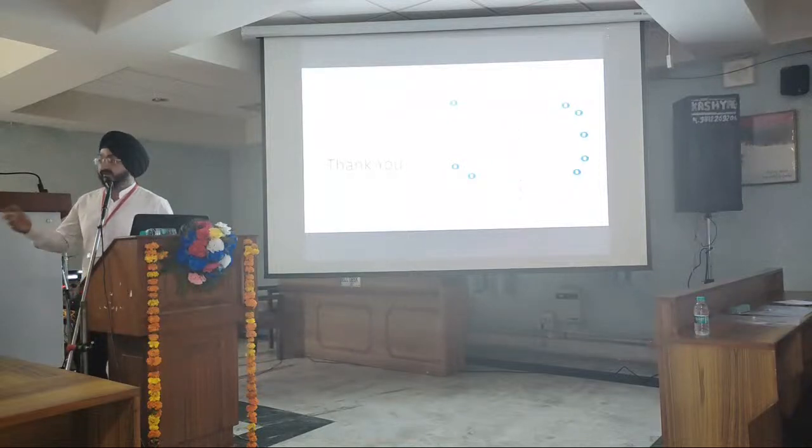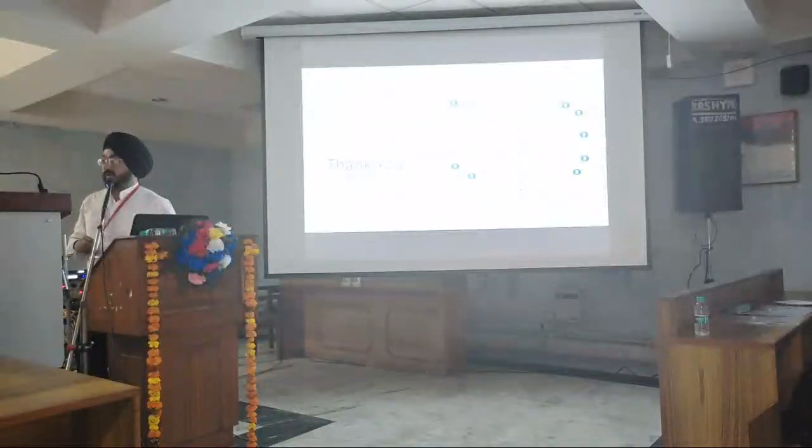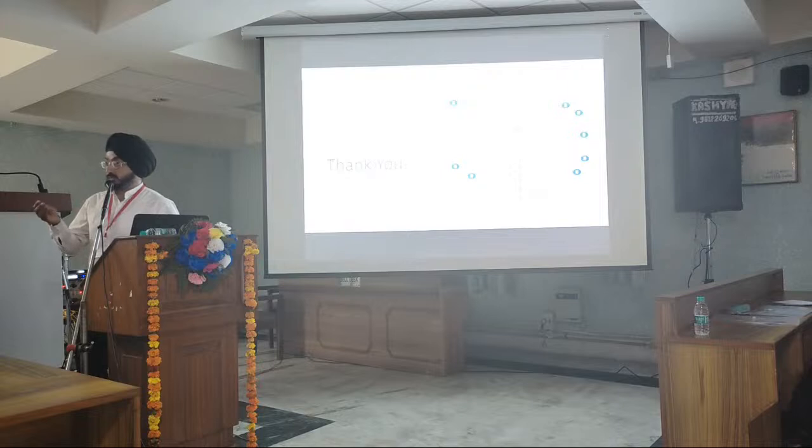But how these earlier detections impact survival, we don't know. The area most involved is where we can get the biopsy. To start with, if you have a case in which mpMRI couldn't be done, or mpMRI is inconclusive, or MRI is definite but you are not getting the cancer on the biopsies, these difficult cases are the ones in which one can begin to use it. And this is for diagnostic purpose.